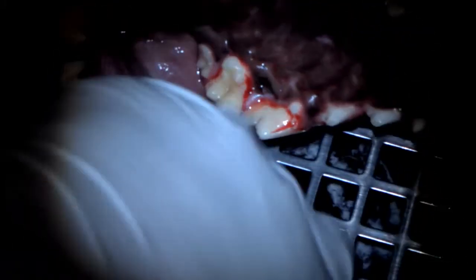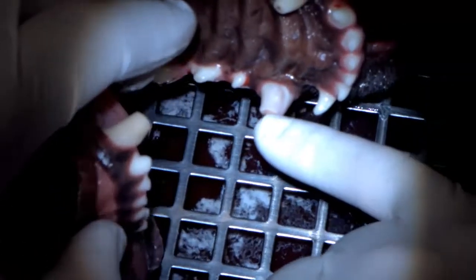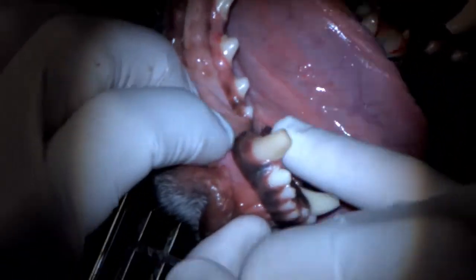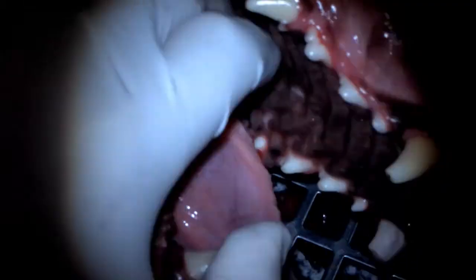We have an eight-year-old chocolate lab. We've already done endodontic treatment on non-vital upper left canine and lower right canine, and we've done the oral hygiene procedure. The gums are a little bit oozy from the scaling and polishing.